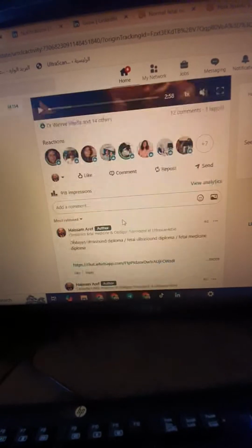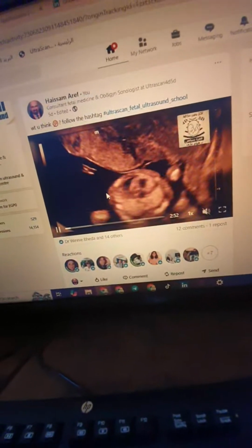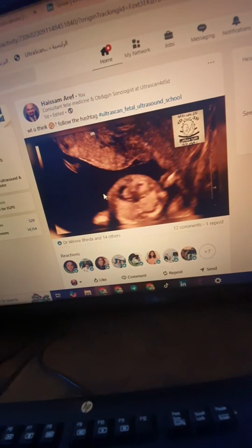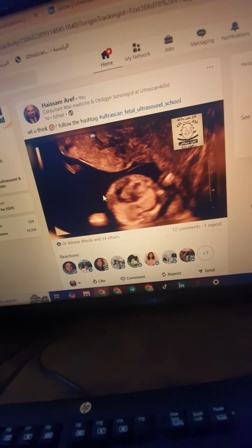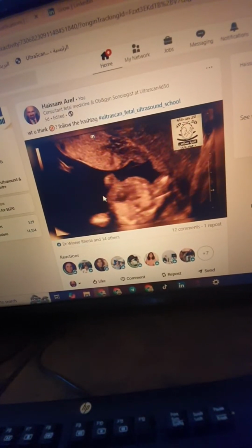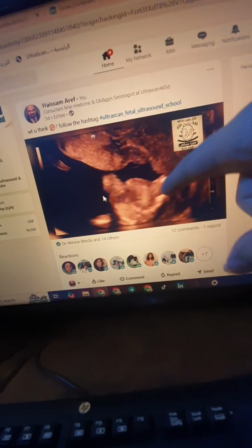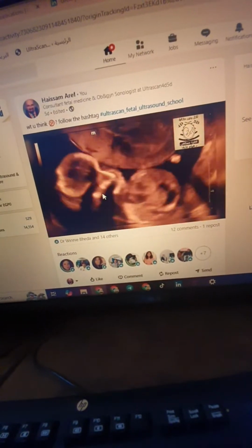Yes. So let's take the wonderful answer by Dr. Nicholas. Here we do have one ventricle, and I guess I'm trying to say that it's a double inlet left ventricle with heterotaxy. Double inlet left ventricle, monoventricle, with heterotaxy, because this case is around 13 or 14 weeks, so it's very early to give a final diagnosis.